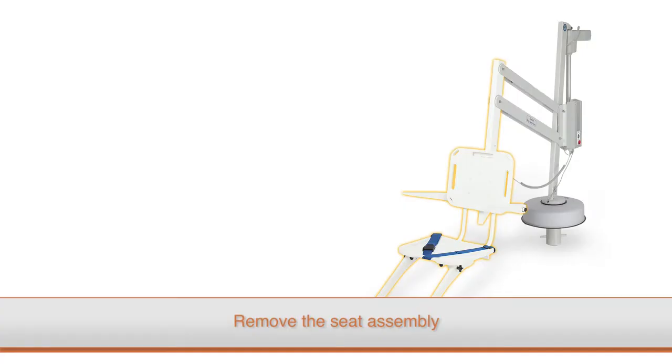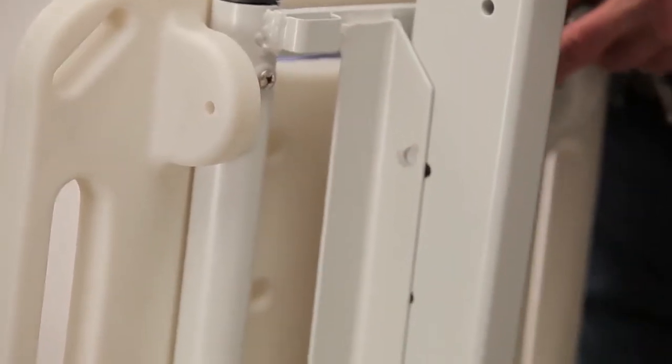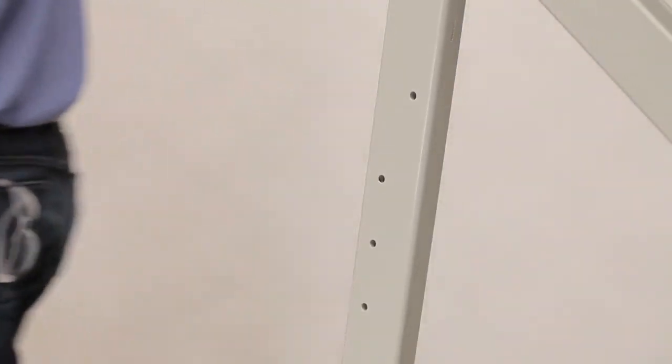Next, remove the seat assembly. Loosen the thumb nut on the bolt that attaches the seat assembly to the arm. Remove the bolt, then remove the seat assembly.